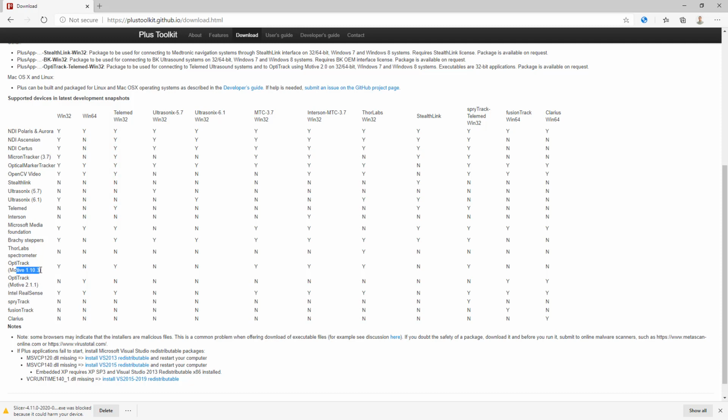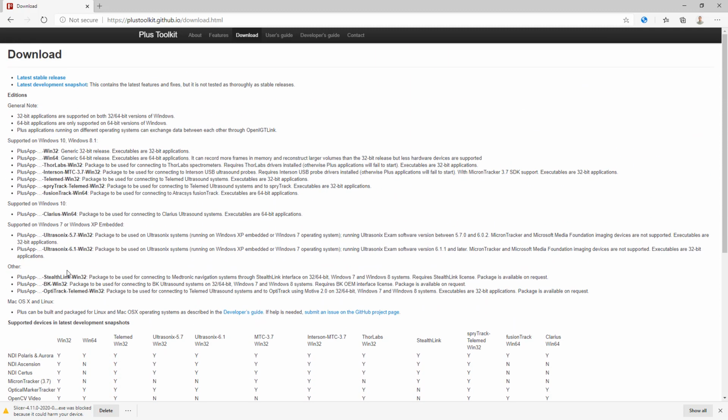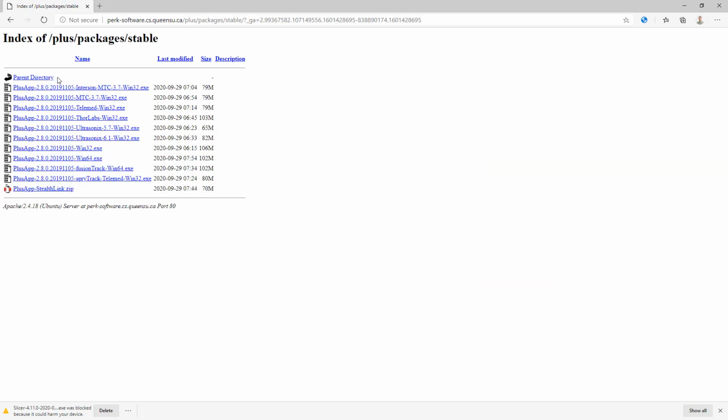Plus has many editions, so we are looking up here what is appropriate for our hardware, which is Telemed ultrasound and OptiTrack for real-time optical tracking. So we need to download the Telemed Win32 edition of Plus to operate these hardware devices.